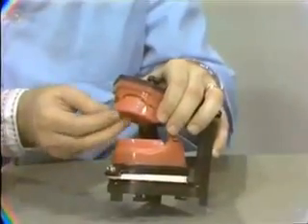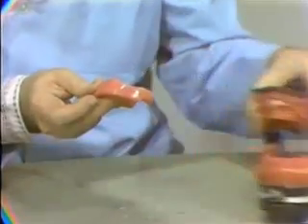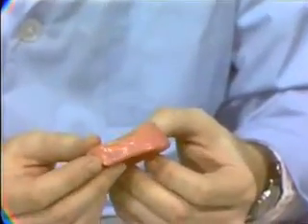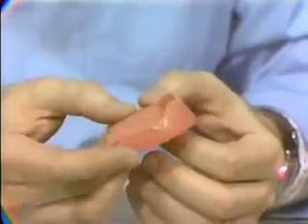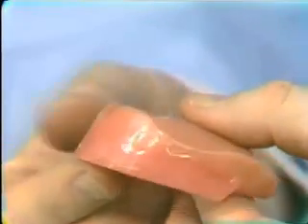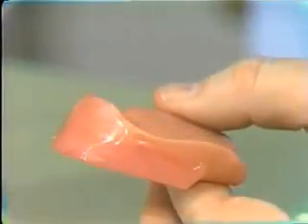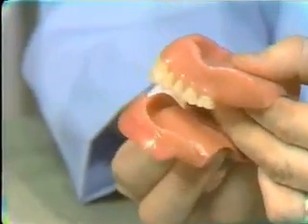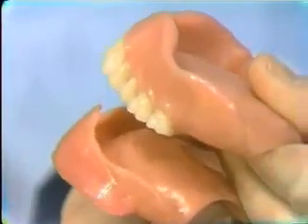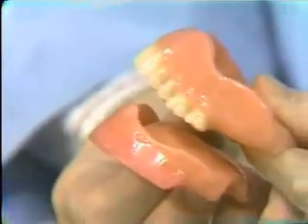At this time, let's take another look at this upper rim. So this is a little more difficult to contour. Now you'll notice again that the anterior portion is labially inclined. And this is a guide to setting our teeth. I have here a denture that was made clinically, and you can see this same anterior labial inclination.